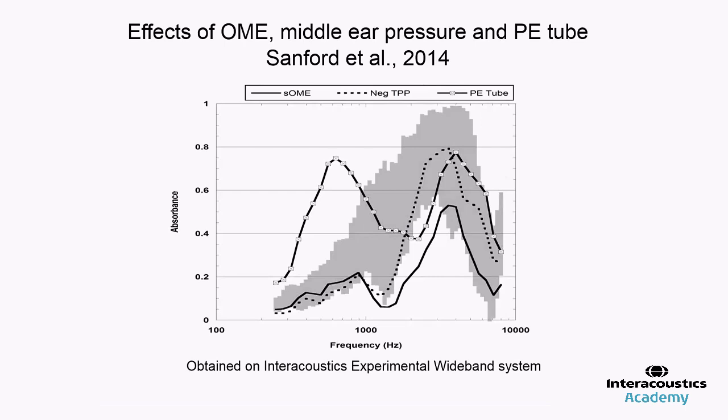as an audiologist. And the Titan has some pictures that they provide to you of different types of pathologies, but I would just take those as a general indication. You can't use that specifically to diagnose a particular pathology. It's meant to just aid you in interpretation.